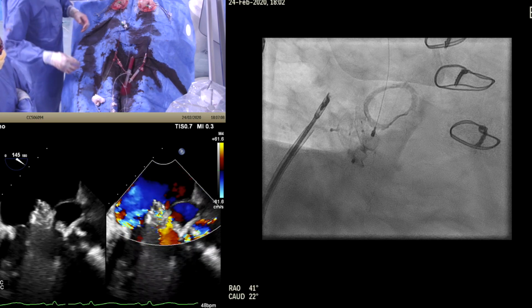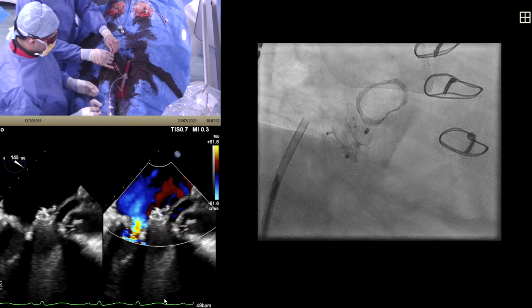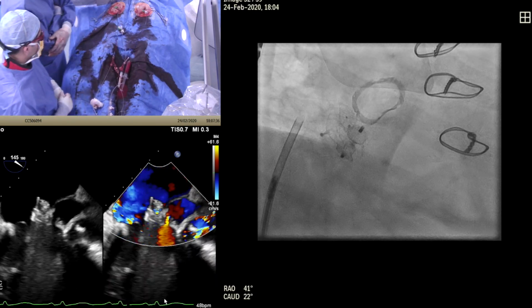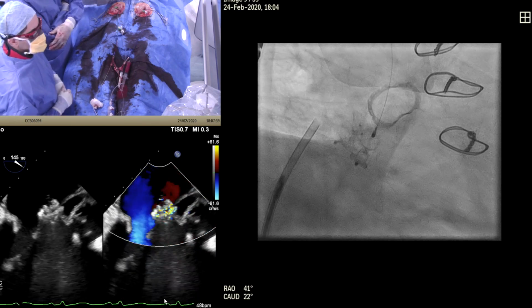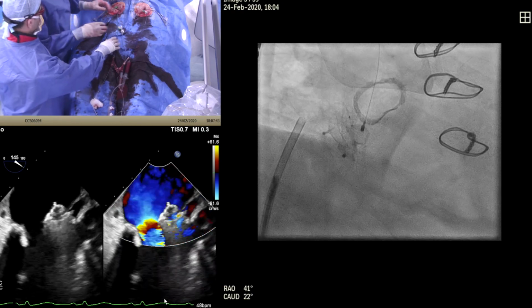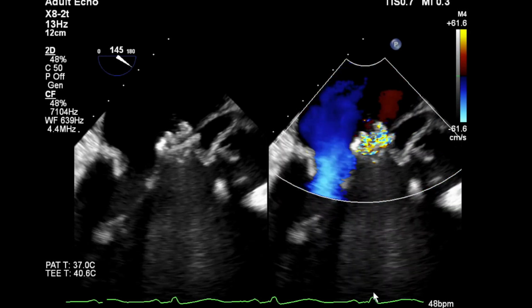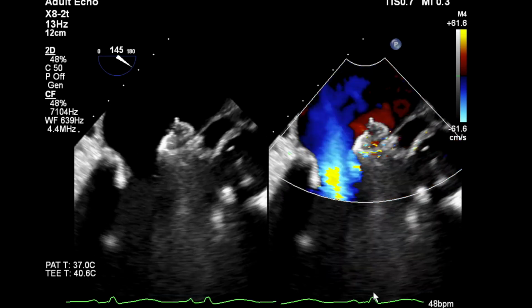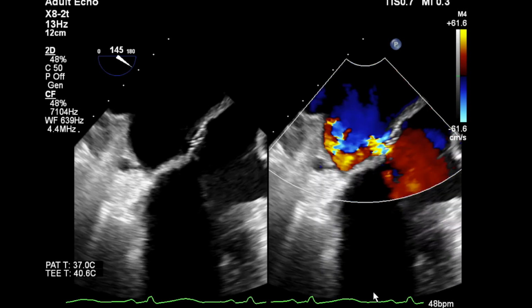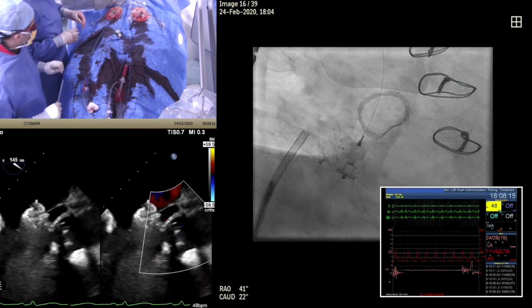Yeah. So I'm going to release the other cable. So we're going to put the screw on. Okay, fine. So we've now released it as well. We've got nothing across the aortic valve, so the AR should be better. Yeah, so the MR looks good. The MR through the devices looks amazing. There's hardly anything. There's just small jets. So we're just going to pull that out of the atrium. Just setting IVC, but just not on the left side. You can see the other defect that we've talked about, but that's another defect for another day. The AR's gone. Aortic valve looks fine.